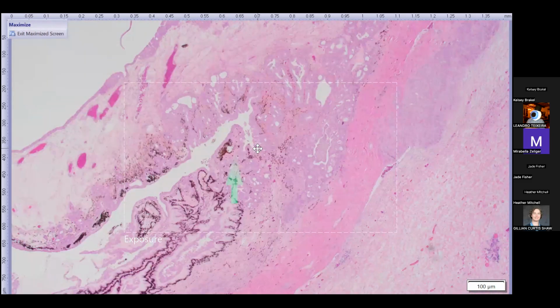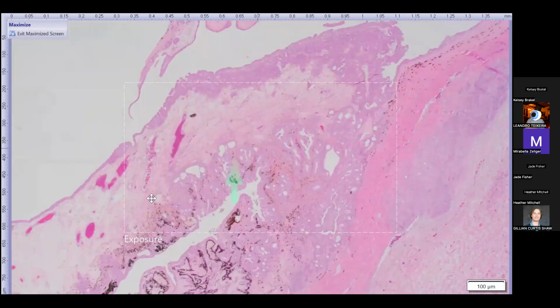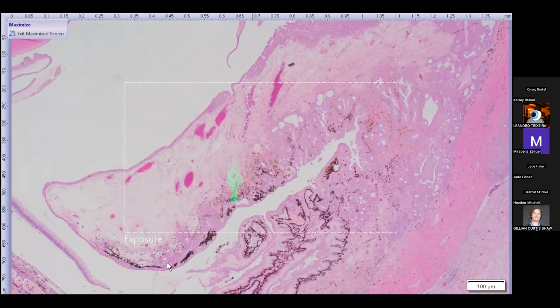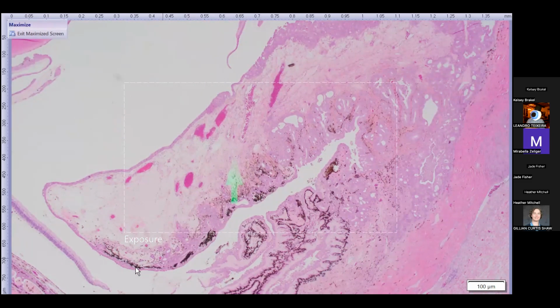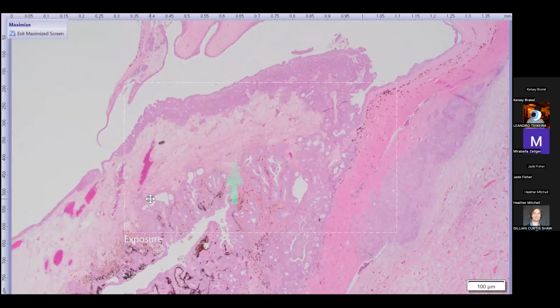At this side, the iris is actually still easy to define. We can make out where it's at. The pigmented posterior iris epithelium is still here, although it's disrupted by these abnormal cells. Then you can see these cells carpeting the entire surface of the iris all the way around and then invading the stroma. And the iris stroma itself is very severely edematous. So really invasive.